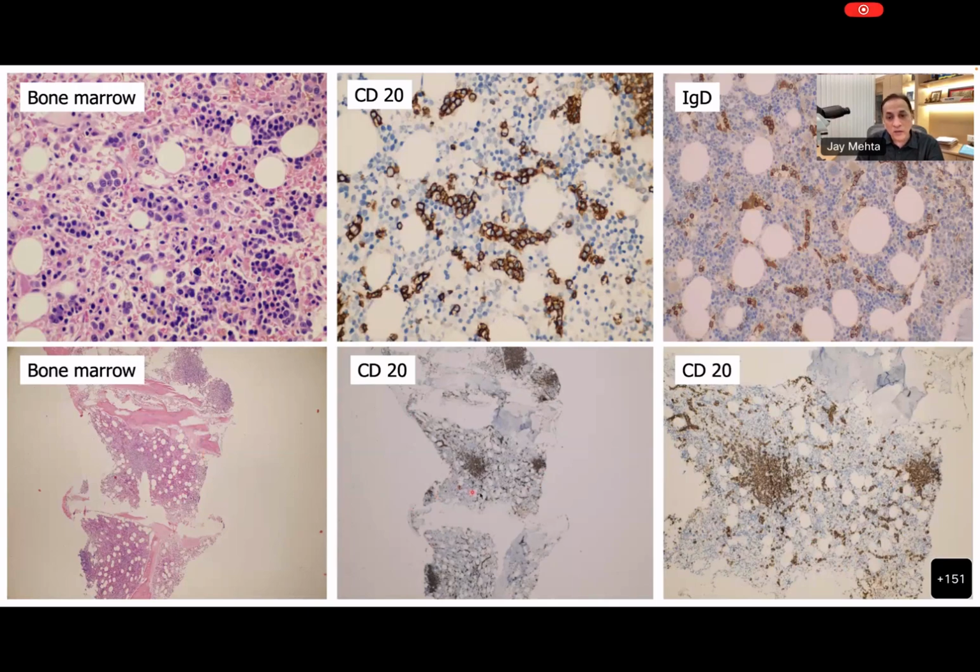You can also get a nodular pattern in the bone marrow as well, and sometimes you can even get prominent follicle germinal centers being developed inside this infiltrate. So that's something that you can expect to see. Besides reactive germinal center, that's the reactive lymphoid aggregate, which can also show you a germinal center. Splenic marginal zone lymphoma is something where you can actually see a germinal center, and that's not a reactive thing, but it's likely to be neoplastic.